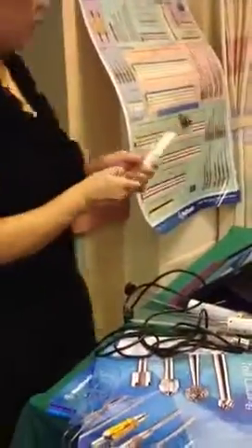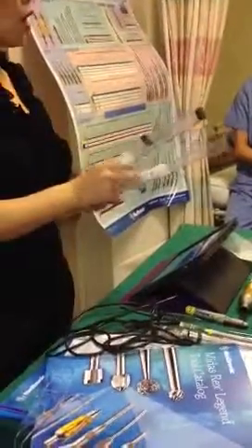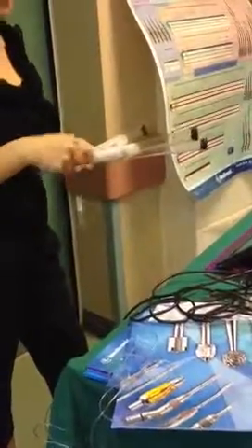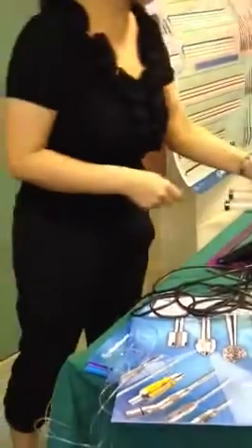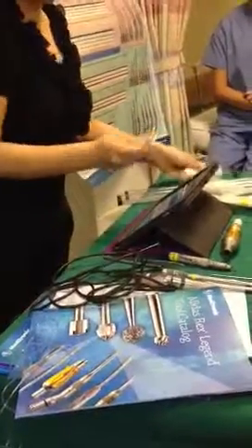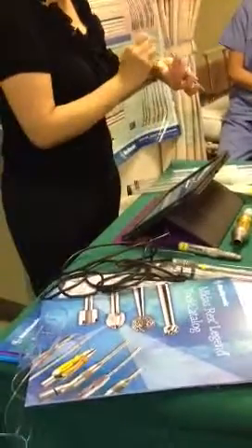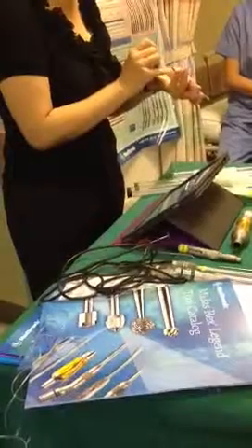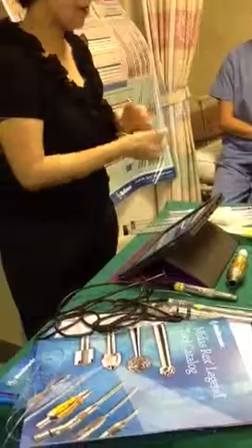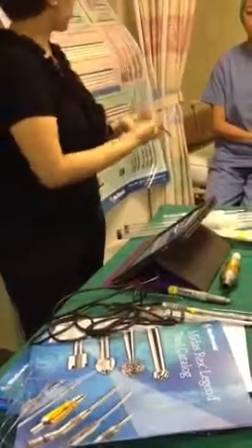Now what we are going to encourage, this is an additional point: we are going to give you the brushes and put them in the set. TSSU or TSSD have a set to wash, so you can clean it intra-operatively. That means the scrub nurse, if possible, always brushes in one direction. Okay? Then you just brush through.